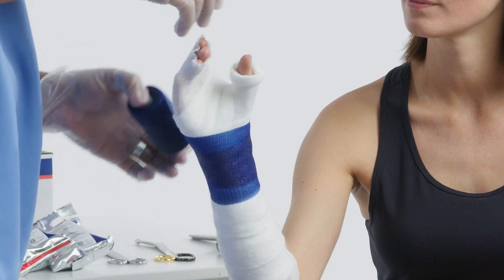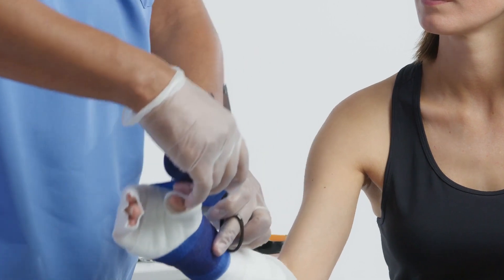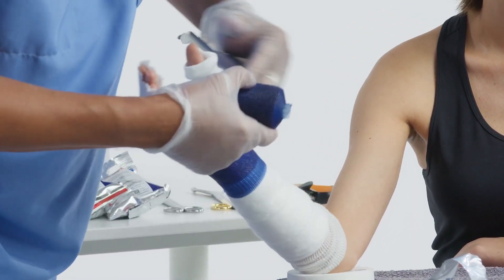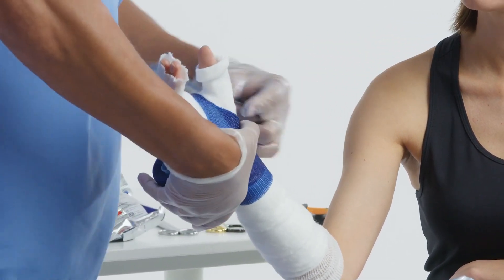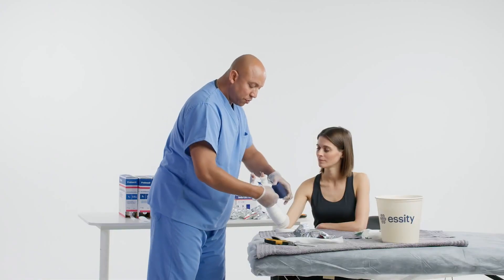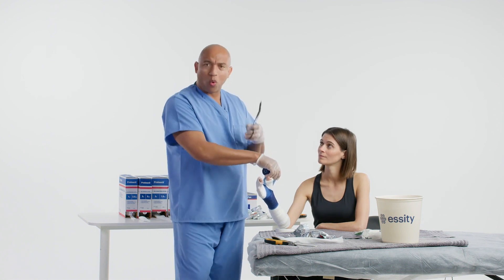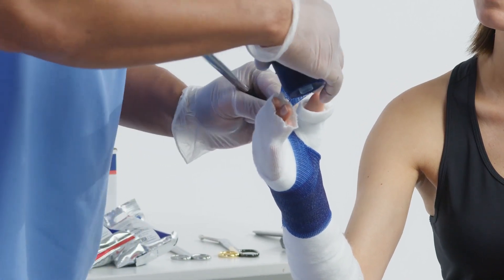There's a particular area that is important — when you go through the web space, we want to do what we call a JJ cut. I'll put the hand down so you can see: just do a little curve, then flip these little sharp edges over. On the volar aspect, you will see there's hardly any sharp edges hanging out that can cause irritation to the patient. Our goal in the web space is to have that width no larger than the index finger itself, because we want to have good opposition of the thumb and index finger.